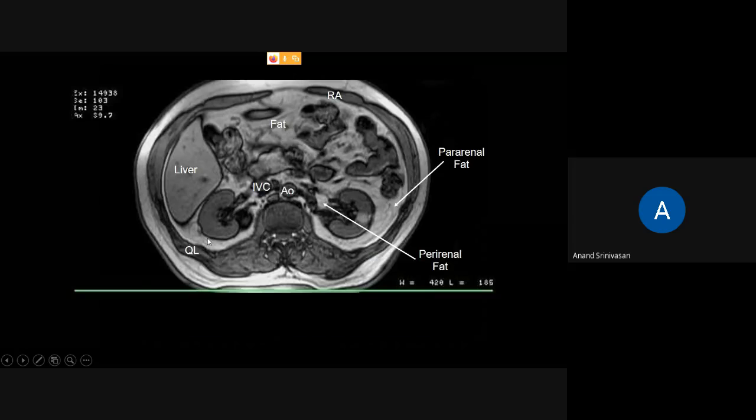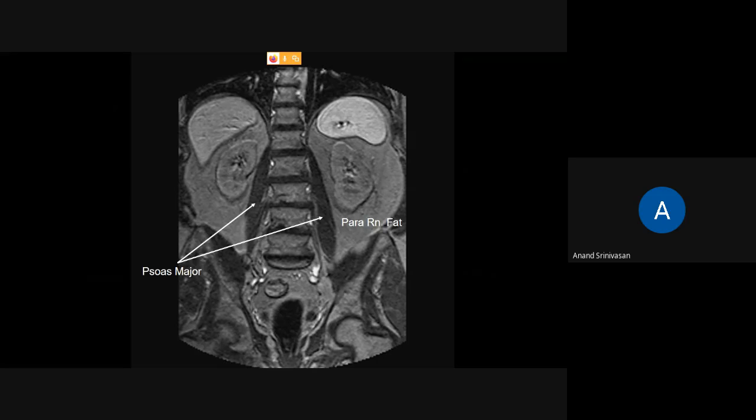This is an MRI picture. This also shows the different techniques. In MRI pictures, you will be able to see the fat also. For example, if there is any perirenal abscess, or any abnormality in the fat present in the peritoneum, in the greater omentum, or surrounding the abdominal structures, that can be detected using this MRI. Usually the perinephric abscess can be found out using an MRI.